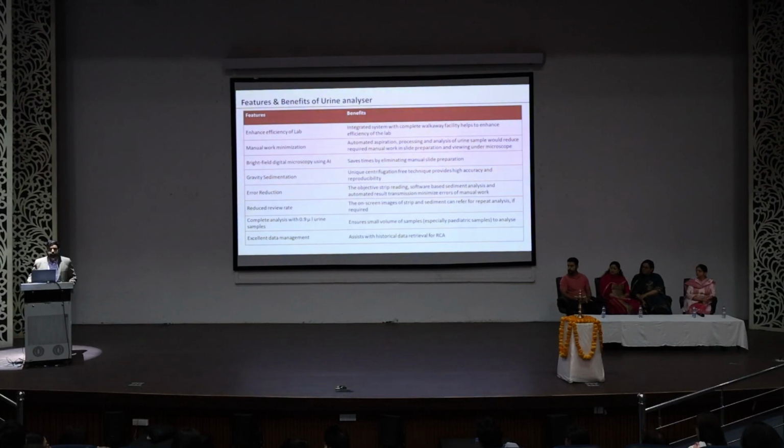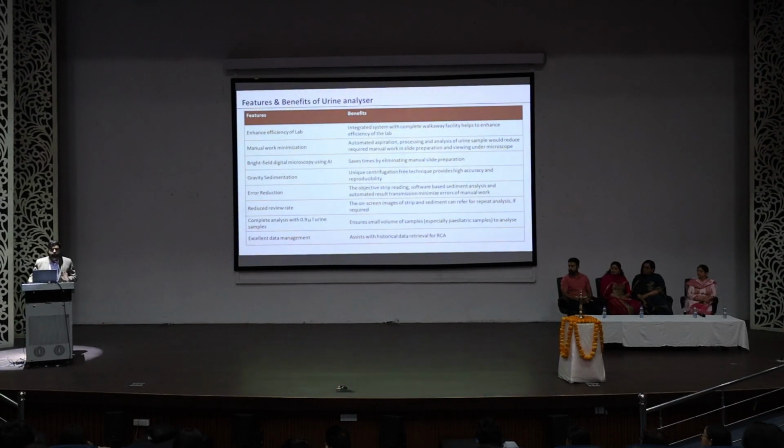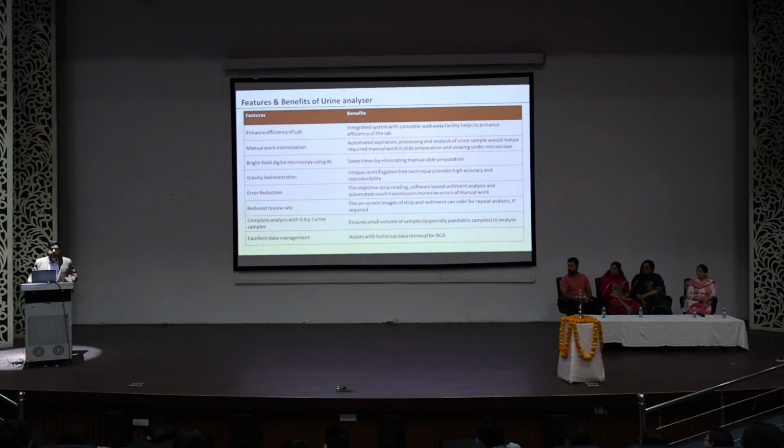But if you have any image which you have seen in the microscope but which is not available in the system, you can check those images, collect those images and put them in your pen drive. The same pen drive can be inserted into the software, and the software will capture it further.